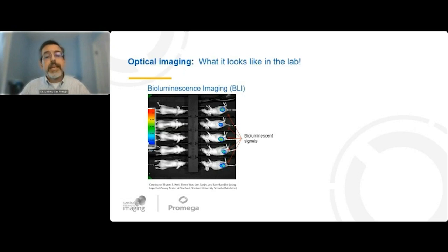What we're looking at here is an ectopic tumor model. And what you'll also notice is that the optical data is not presented alone. It's typically presented with a white light image in the background to give better location information on the optical imaging data.